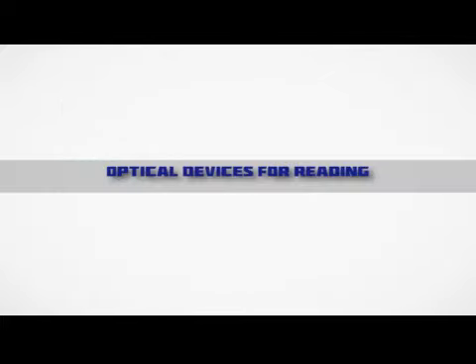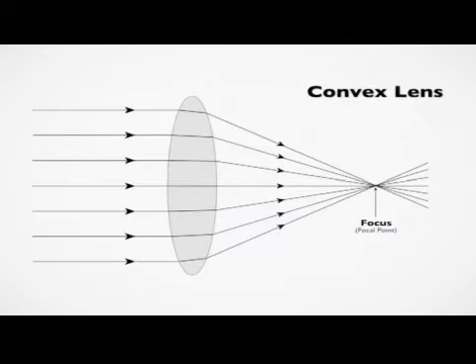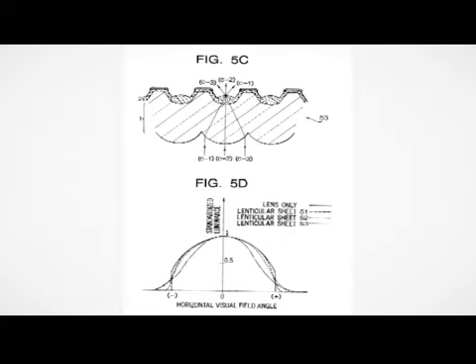Optical devices for reading. Spectacle magnifiers. Low vision spectacles are monocular or binocular convex reading lenses mounted in standard full diameter or half eye frames. In other words, they are really simple magnifying lenses fitted into a spectacle frame. The convex lens functions to enlarge the images projected on the retina. The lenticular design lenses have less peripheral aberrations.